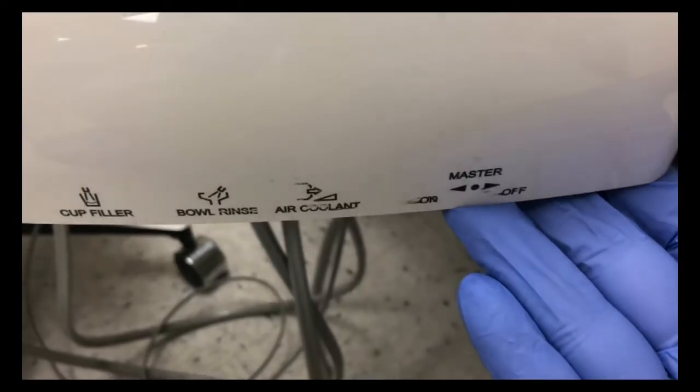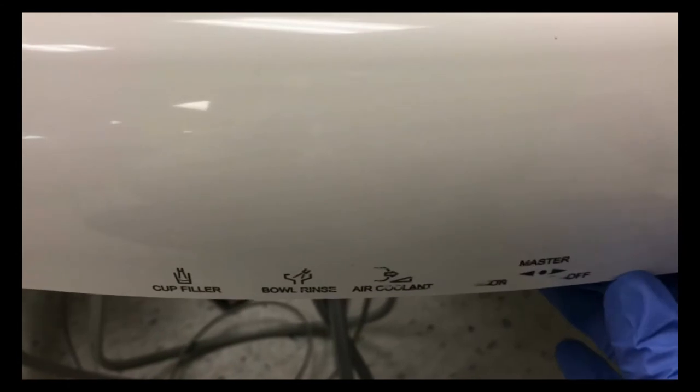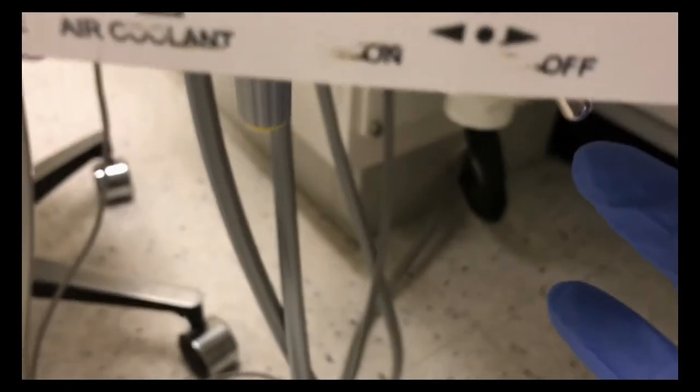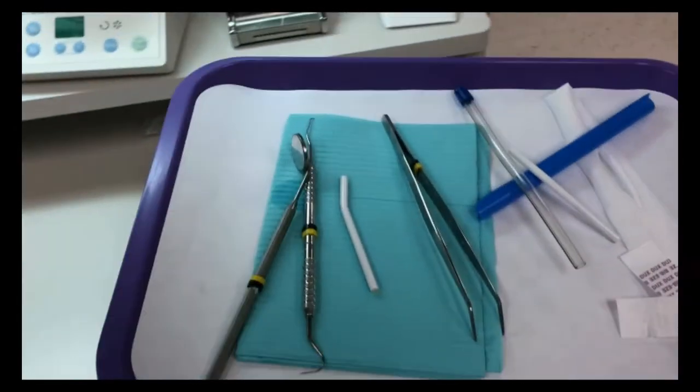Turn off your dental unit. Verify that the toggle is in the off position and turn the water switch off on your rheostat.